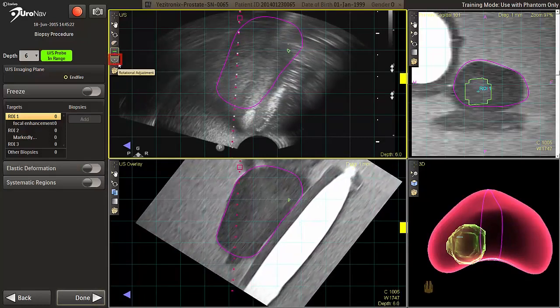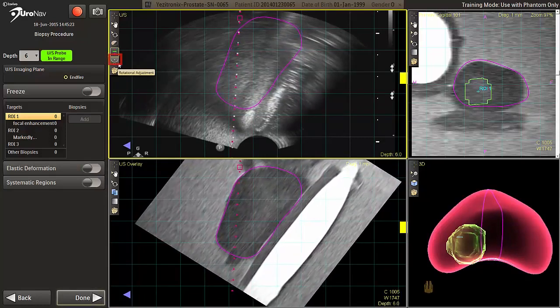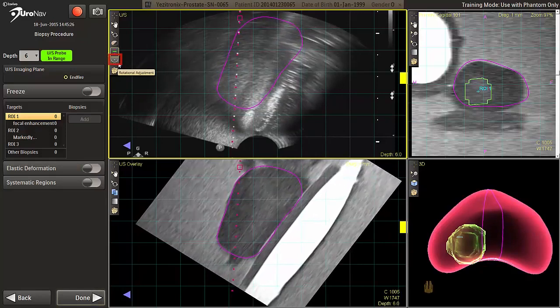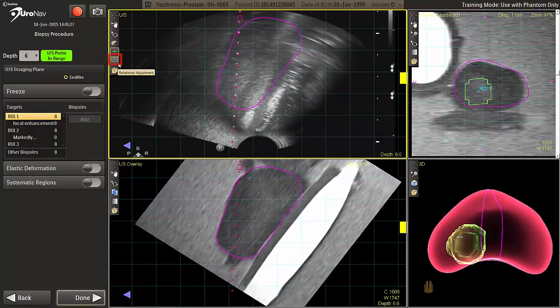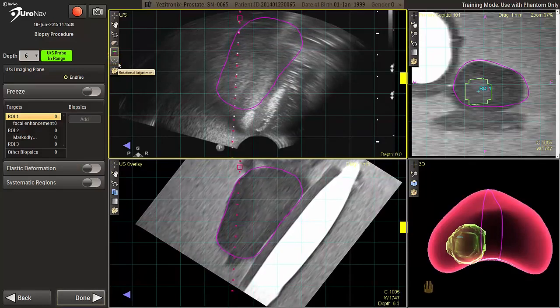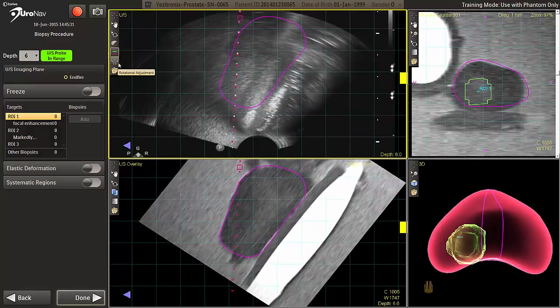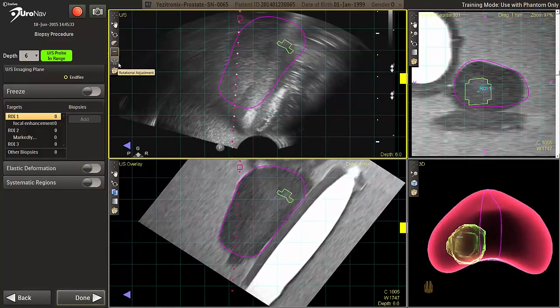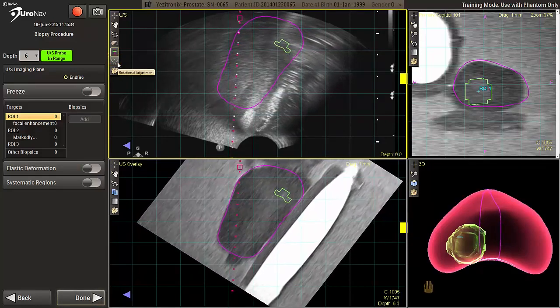N-fire probe users are encouraged to perform rotational adjustment. The tool for rotational adjustment steps is activated on the static toolbar on the left of the live image viewport. For more information on rotational adjustments, refer to the Euronav user manual.